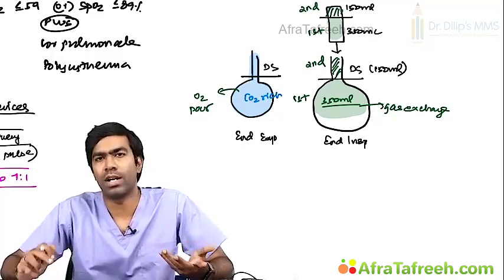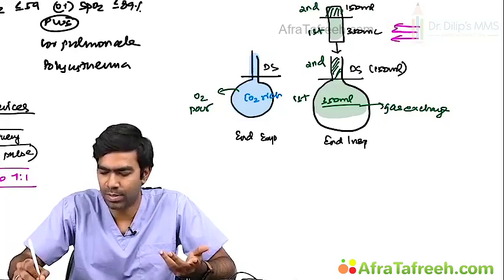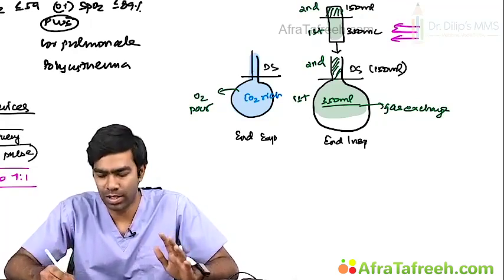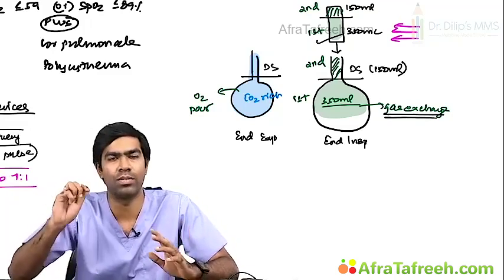So why do you want to give continuous oxygen? If you deliver a pulse during the initial phase of inspiration, that itself is enough, isn't it? It's going to help in the gas exchange. So you do not need to deliver continuous oxygen at all. During expiration, why do you need a continuous flow of oxygen? Similarly, during inspiration itself, why do you need a continuous flow in the later part of inspiration?